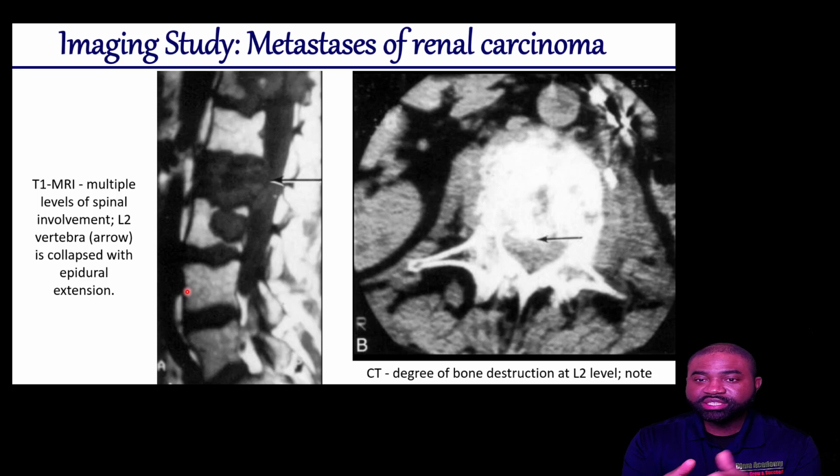Bear in mind that in T1, fat appears bright, and in T2, water and fat appear bright. Now, what this implies is that if you look at a T1 weighted image and a T2 weighted image, in a T2, the cerebrospinal fluid is actually more bright.